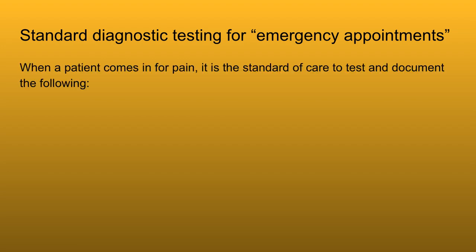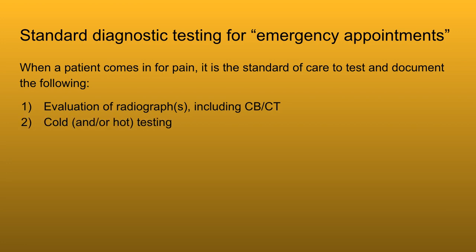So a patient comes in with pain. It is the standard of care. It's important to note that this is the expectation of our state dental boards: to, one, have a good standard testing process for diagnosis, but also to document it well. So first and foremost, what is the evaluation of the radiographs? Simply having the radiographs is not necessarily where the end of the road is. It's what do we see on the radiograph and what do we think that information means that's important.